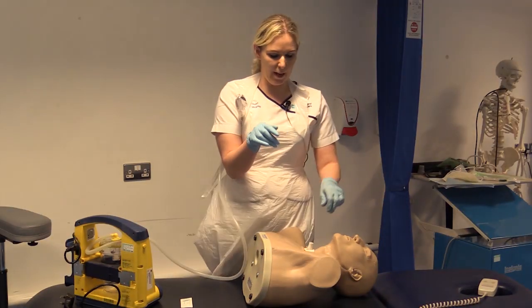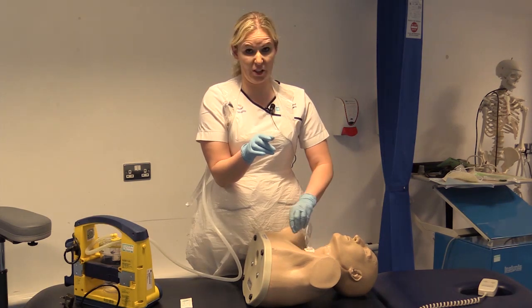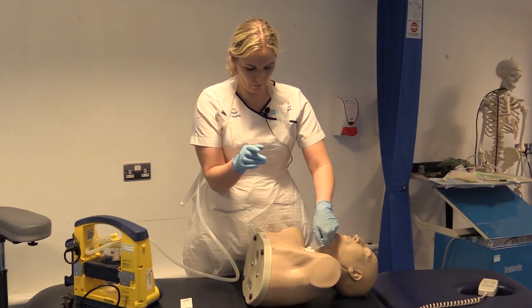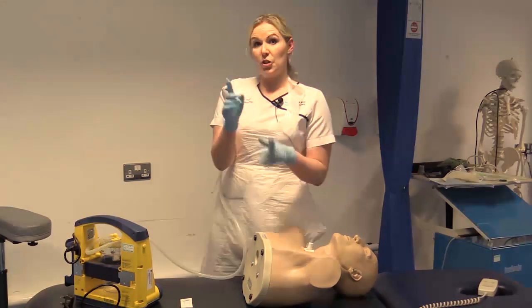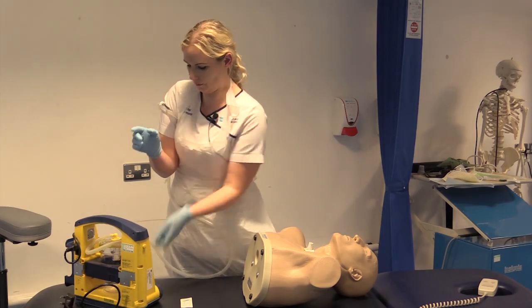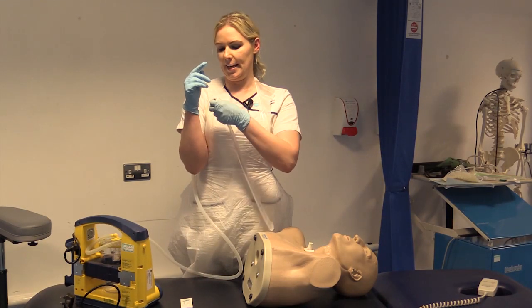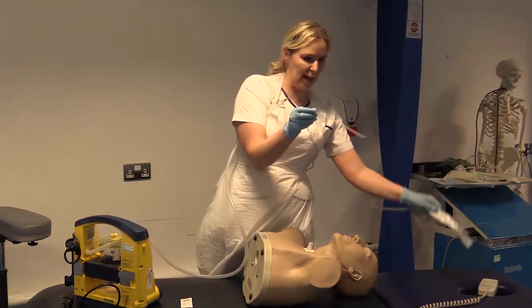I should say at this point as well, you need to just double check before you suction through a trachea that you have a non-fenestrated inner tube. Okay, so you're going to turn on your suction. Okay, you're going to slowly remove your catheter from the plastic sleeve, making sure your clean hand is the only hand that touches the catheter.